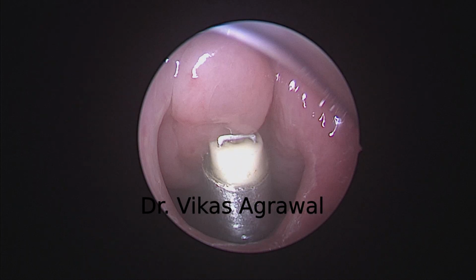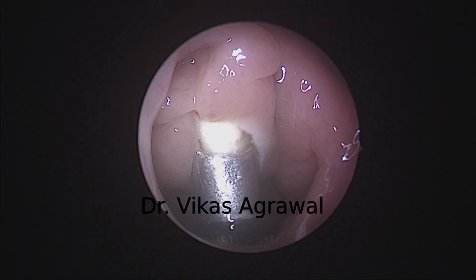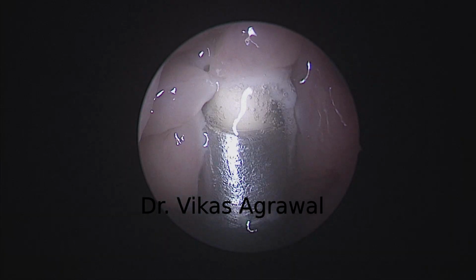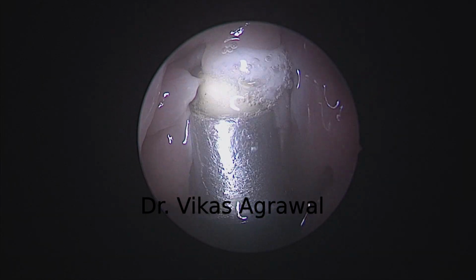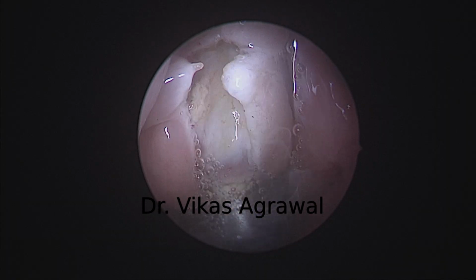So here you are watching Coblation adenoidectomy in a 9-year-old child. I have just performed tonsillectomy, grade 3 to grade 4 tonsils and similar almost grade 3 adenoids.